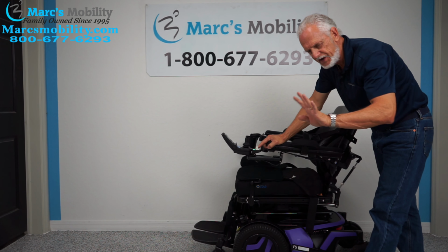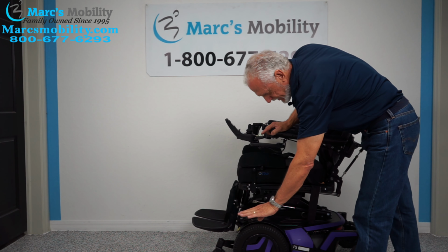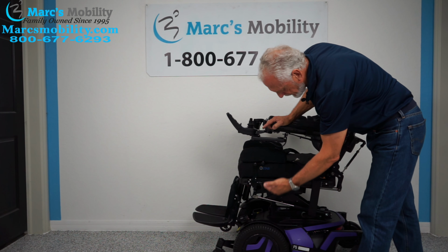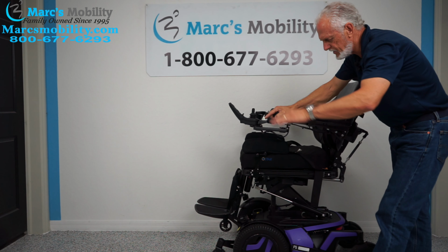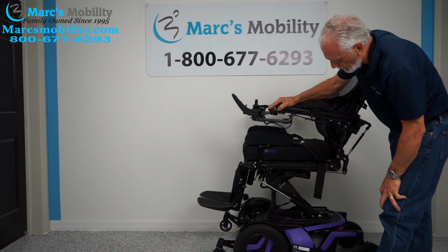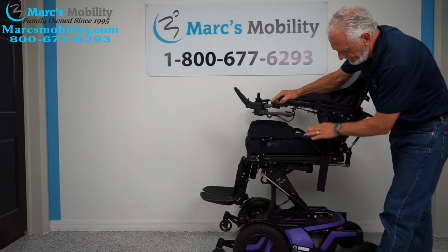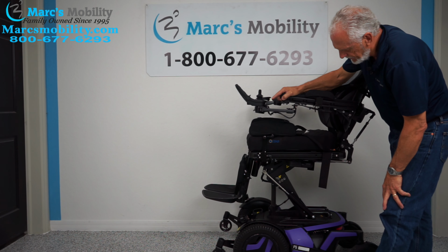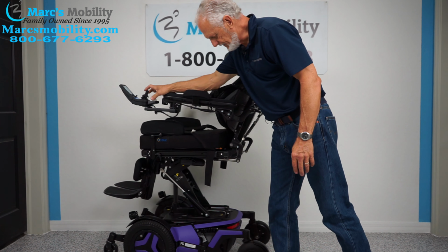This one has a 14-inch seat lift, so it'll start at roughly 22, 23 inches. This chair's a little taller because of all the motors. Roughly 22, 23, and you're going to add 14 inches. You're going to be about 36, 37 inches by the time you're all the way up. Again, this is the seat lift by itself. You can still drive the chair with the seat elevated, as you can see.